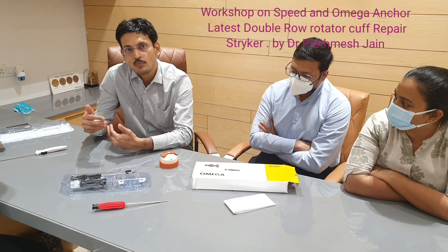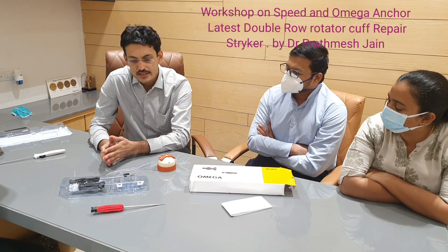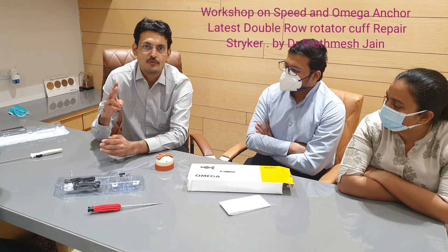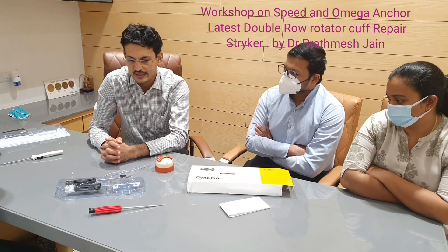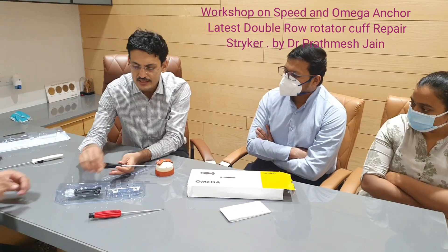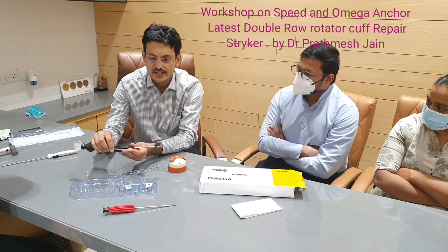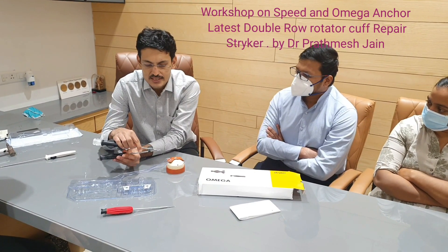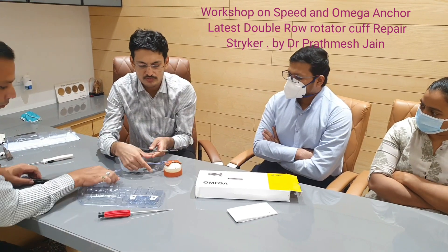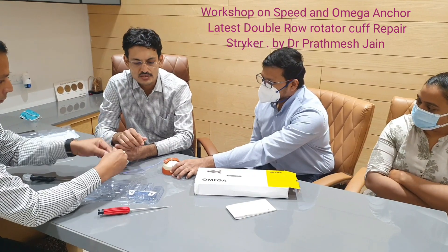This one anchor system, which comes in a sterile packing, gives you two anchors — so it is also a cost-effective system. It can accommodate more sutures on the lateral side, and you only need to open one set for two lateral knotless anchors. This anchor system is the only one which comes in two parts: the first anchor and the second anchor, with the first used to insert the device.